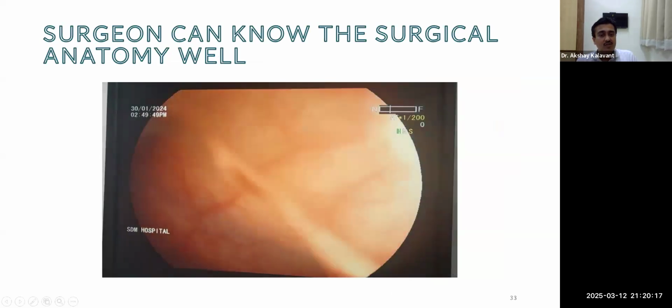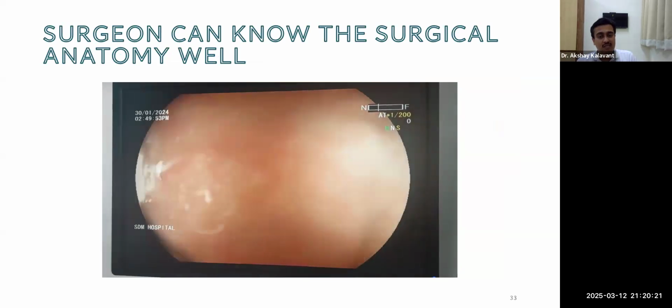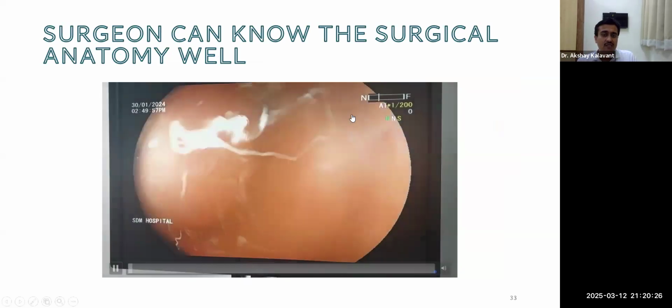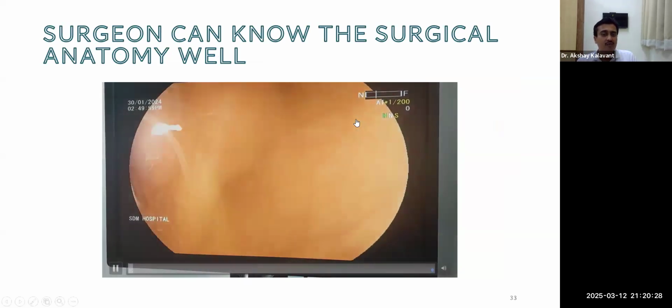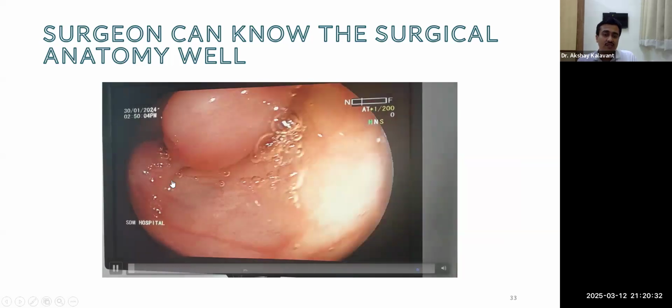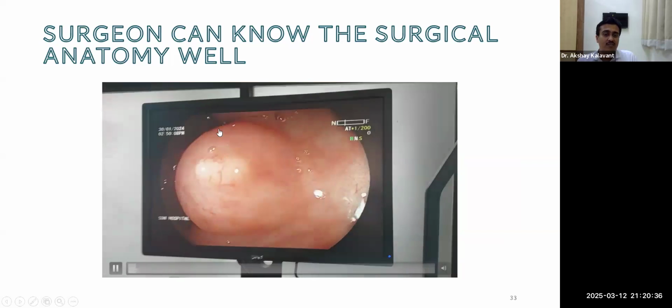This is a case of ureterosigmoidostomy done for exstrophy bladder in a 13-year-old child. This was done around 8 years back, and now he has grown into an adult. He would never come for endoscopy. Now they had to call him for endoscopy because we need to do surveillance of these patients for any malignancy. I could see all these polypoidal things.